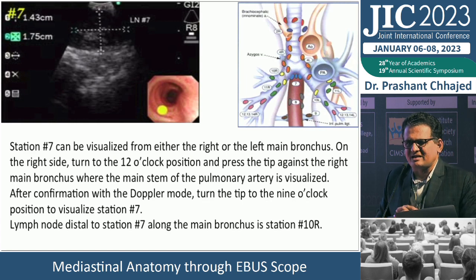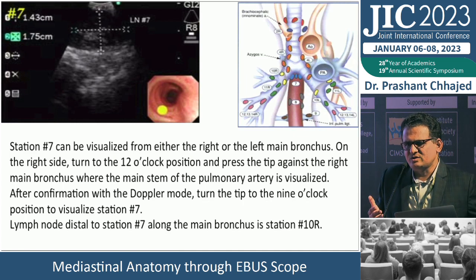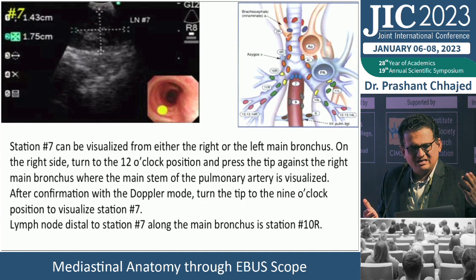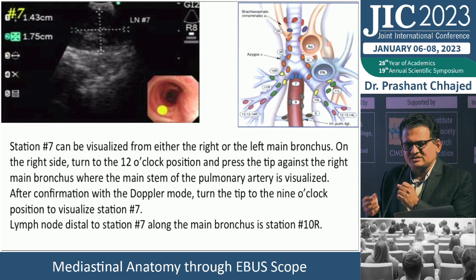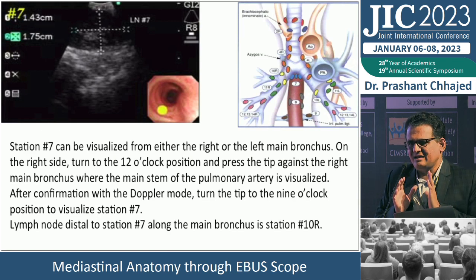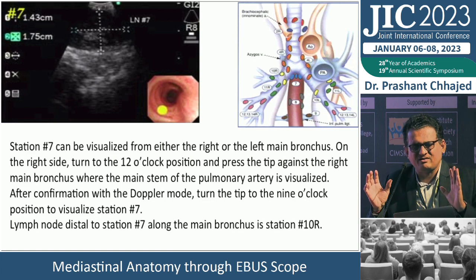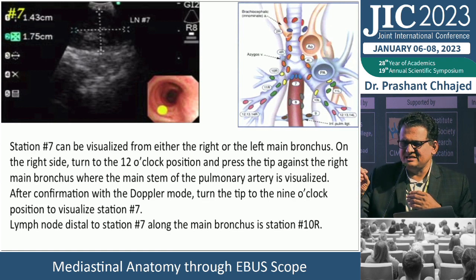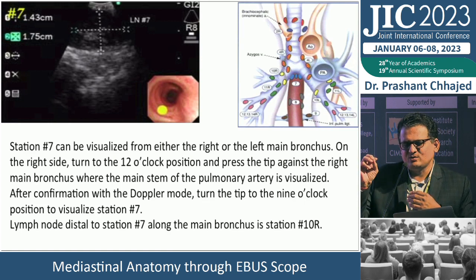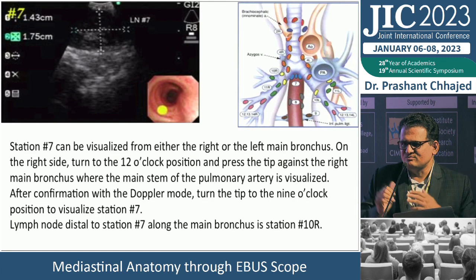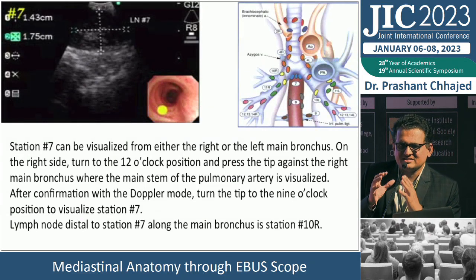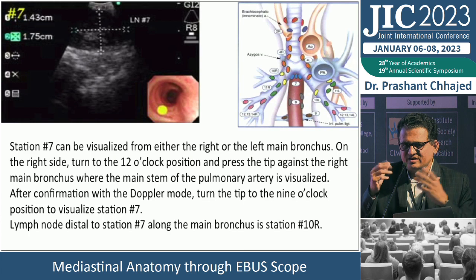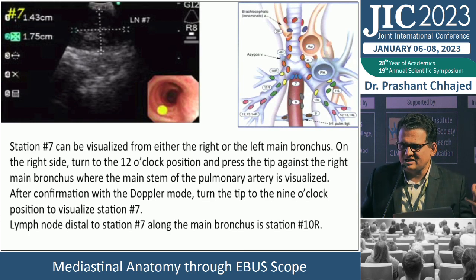For the subcarinal lymph node, you can approach from either the right or left side. I prefer to go into the right main bronchus and sample the subcarinal first if it is a diagnostic procedure — it's gentler on the scope. Turn to 12 o'clock position in the right main bronchus, visualize the main pulmonary artery trunk, confirm with Doppler, then turn to 9 o'clock to visualize station 7. Lymph nodes distal to station 7 along the main bronchus are station 10. For smaller subcarinal nodes, even 8-10 mm can be sampled without problems.